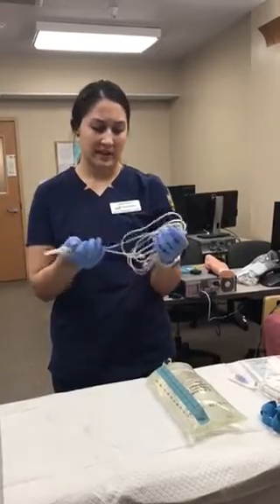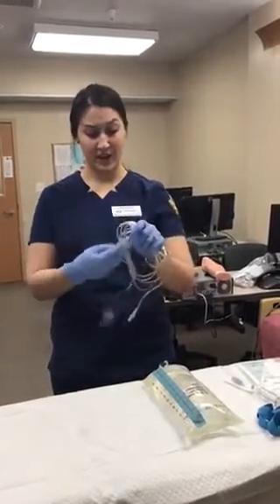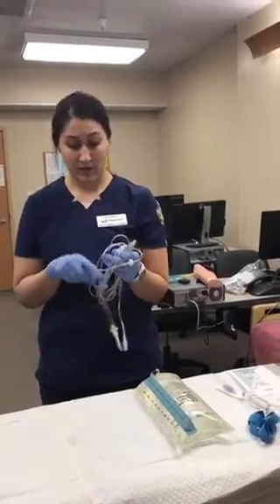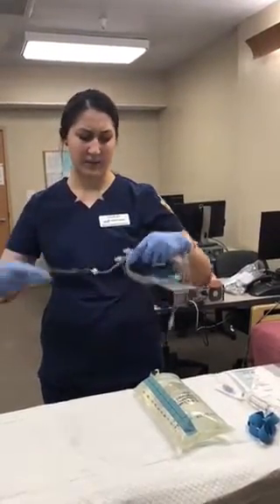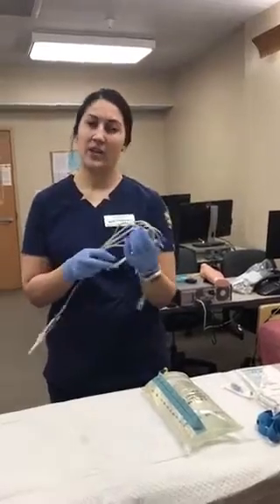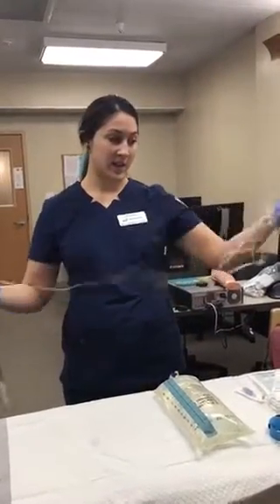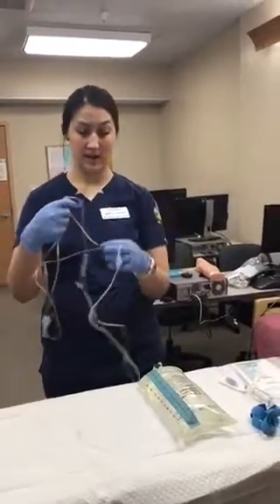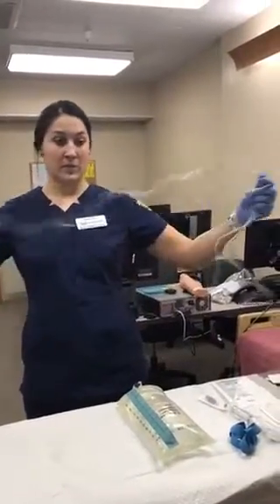This one is definitely a little funky colored, but again, it is within the right date, but I would compare this maybe to another set just to make sure that this color is normal for this tubing, and if not, I would toss this and then get a secondary set.